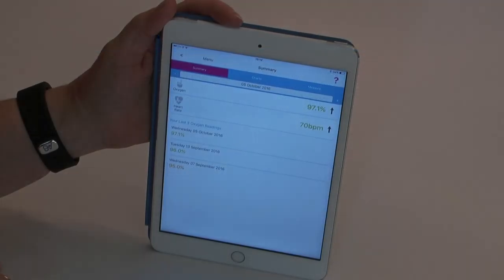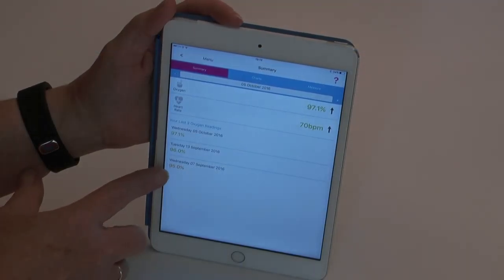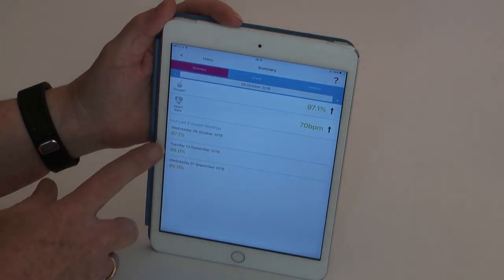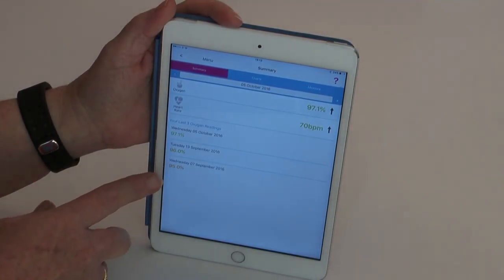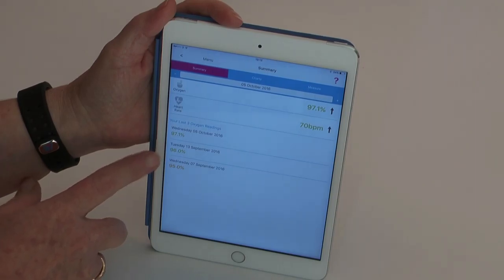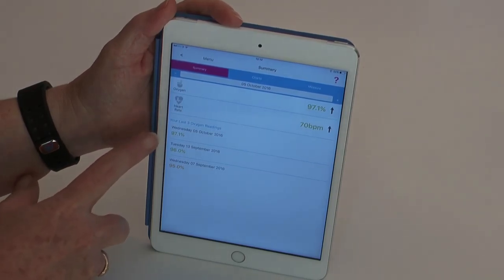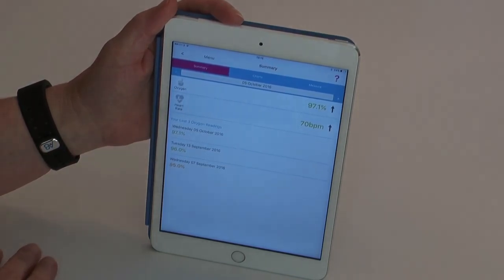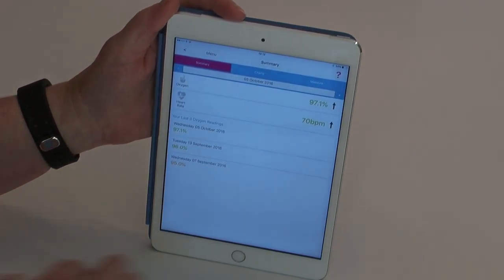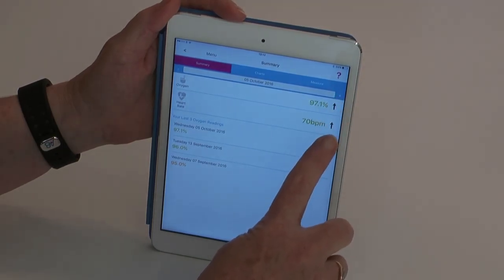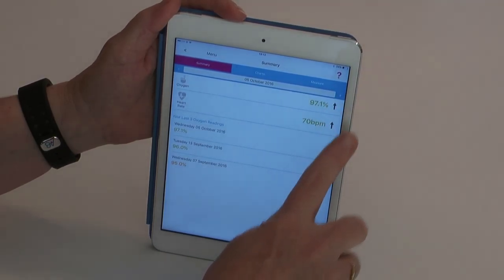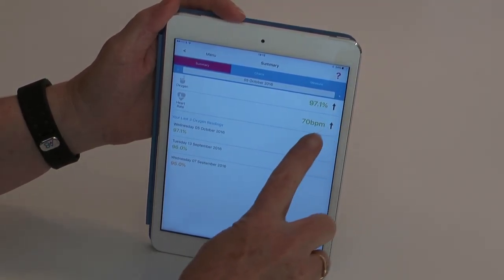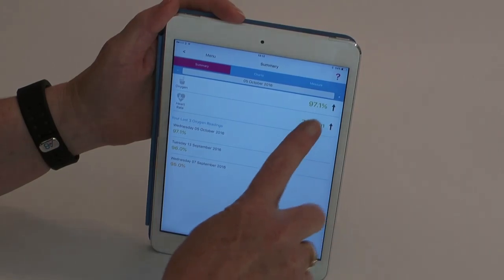The pulse oximeter 2 reading will indicate with colour coding whether it is within normal readings, cautious, or out of range in red, and will also give you a trending arrow which is either rising, equal to, or lower than previous day's readings.